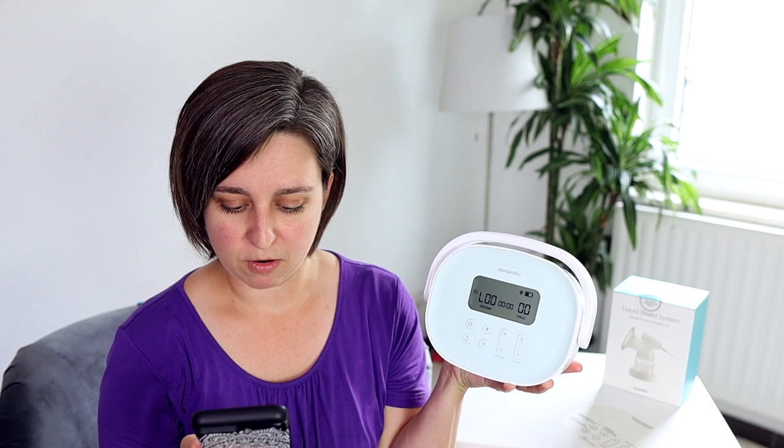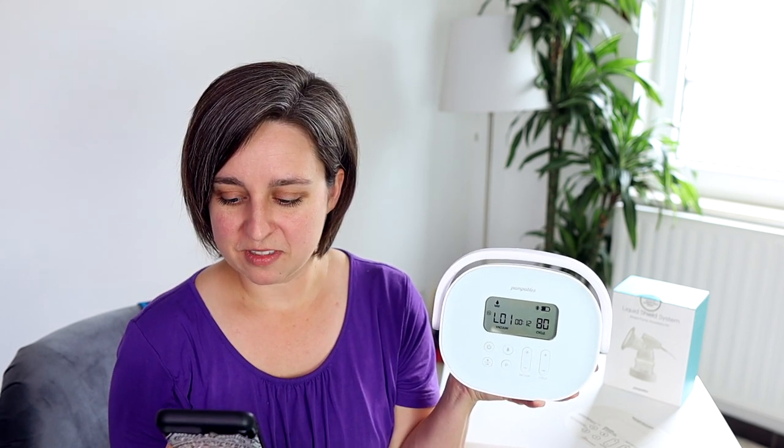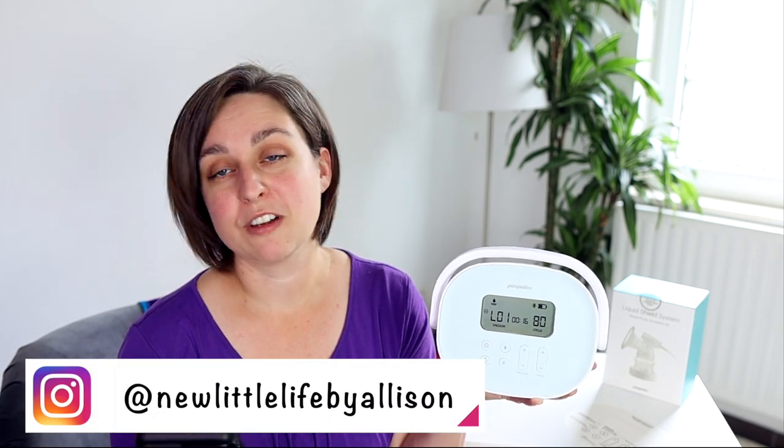I'm actually going to control it with the app just for fun. I'm going to try and hold it so you can see the settings. This is the lowest vacuum level on stimulation mode. If you're confused about modes and levels, you can go watch a video on the channel all about suction. You can actually adjust the cycle speed on stimulation mode, which is cool — not a lot of pumps let you do that. That one was at 104 and you can go from 72 to 104. You do want a higher cycle speed in stimulation mode and letdown mode to help that milk start coming.